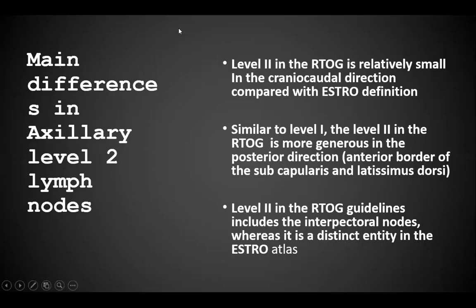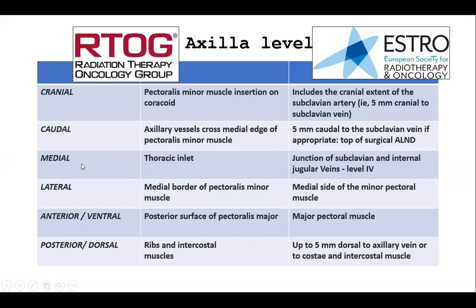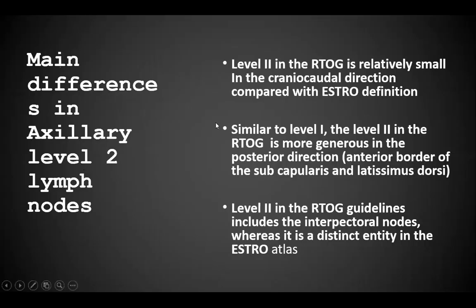So to sum up again, what are the main differences in the axillary level 2 station? Level 2 in RTOG is relatively smaller when we compare with ESTRO.